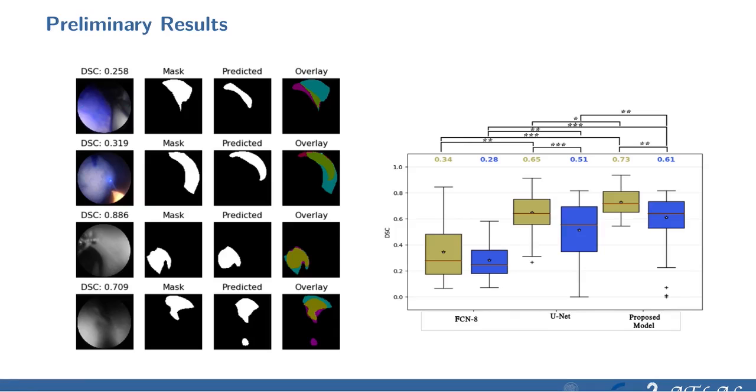Here I am showing that the results obtained with the proposed model are better. Furthermore, we also analyzed different image modalities as input to train the network, in this case image data in grayscale and RGB. We found that the use of grayscale images actually led to better results. But in general, both models trained with our proposed model outperform all of the other previous models tested.